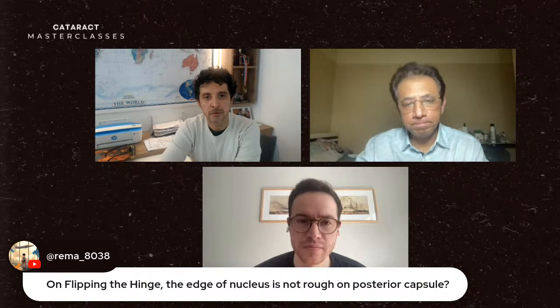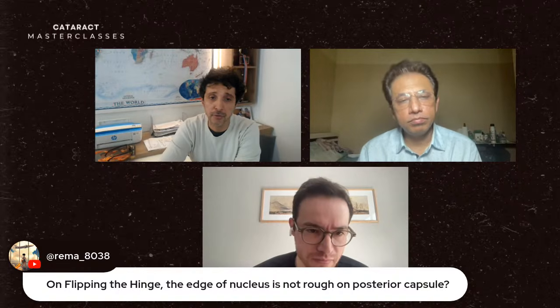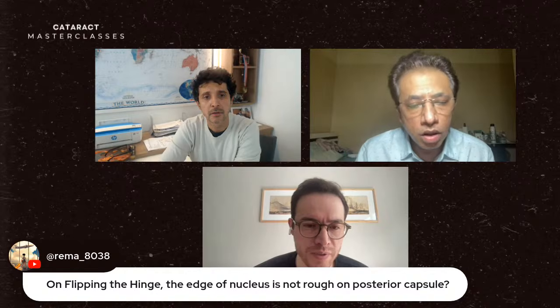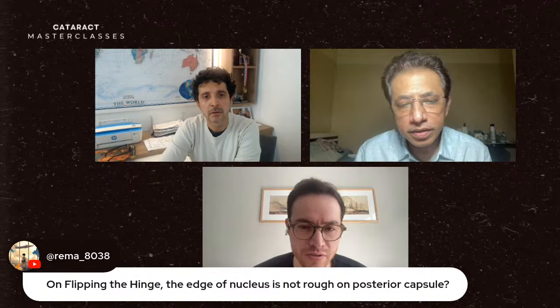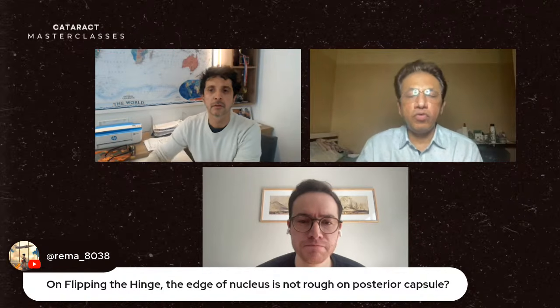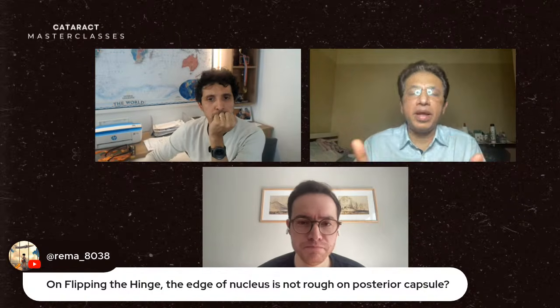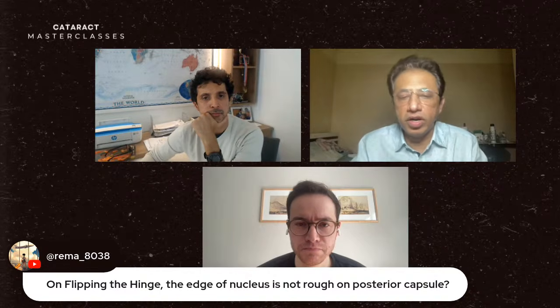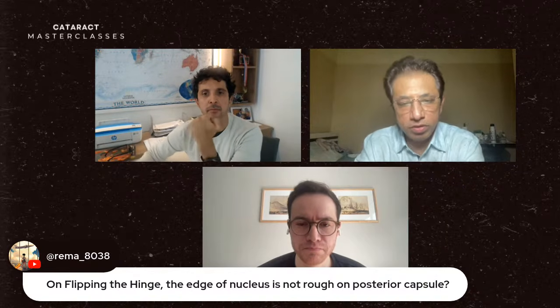Okay. Professor Deepak, there is a question from the audience. On flipping the hinge, is the edge of the nucleus not rough on the posterior capsule? Yeah. No, it wouldn't be. When you flip it up, the edge is actually coming anteriorly. What goes behind is the back surface of the lens. So it won't damage the posterior capsule.